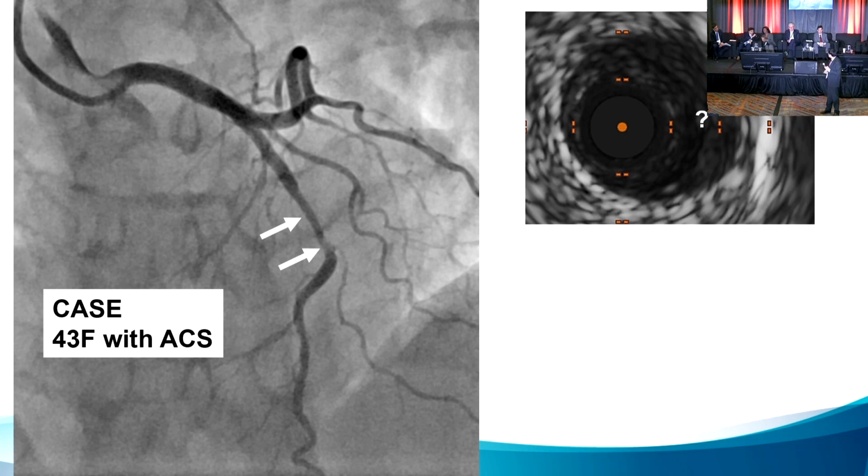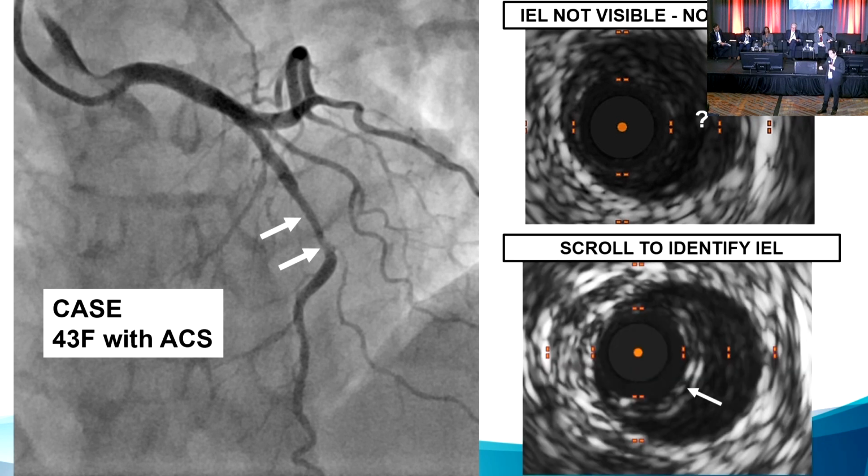Rajiv, one other thing that really catches my eye: you see how the proximal LAD suddenly starts tapering? That's very suspicious of an intramural hematoma. What about the IVUS? I don't think you can tell. This is a digital IVUS, and that's, for me, the learning point of diagnostic IVUS. The digital IVUS is really hard to discriminate plaque, that could be a snowstorm, or plaque, from intramural hematoma.